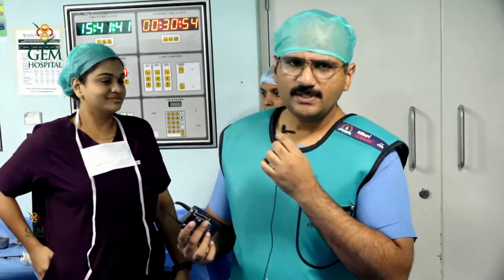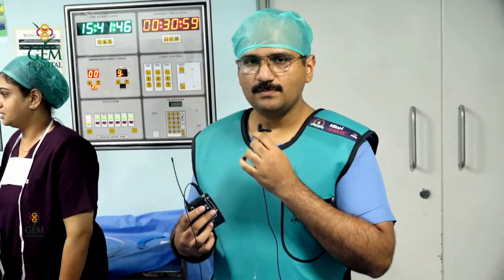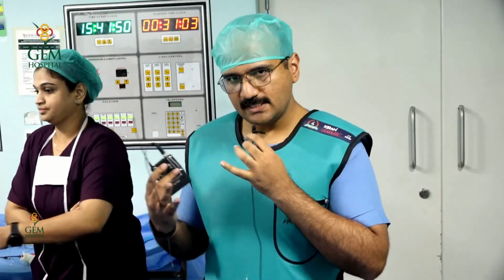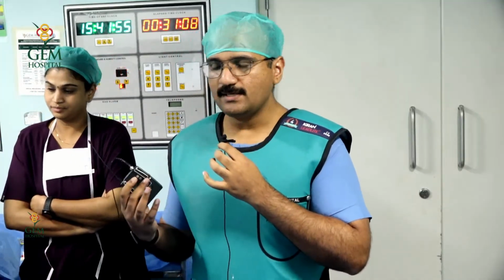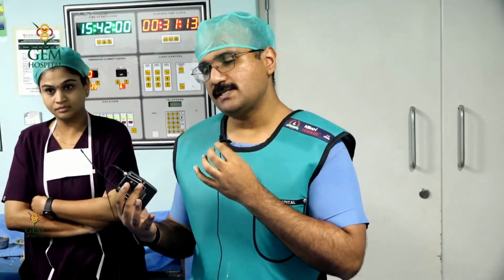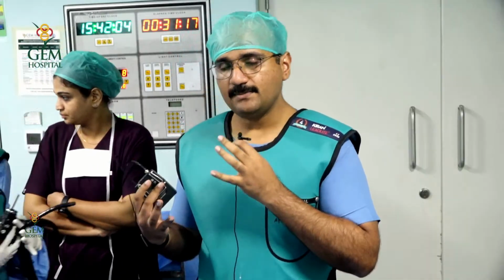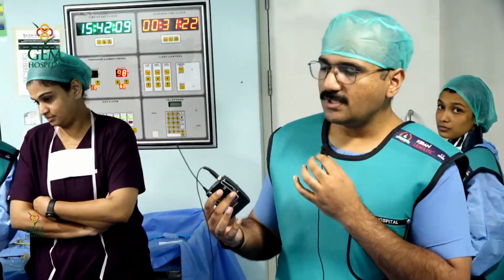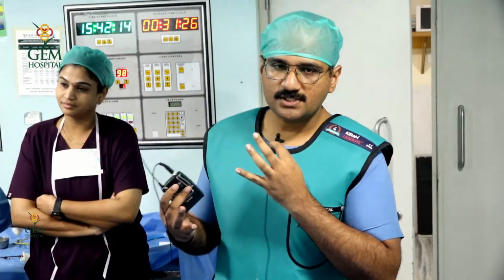The stent can be removed in 6 weeks. Ideally, if it were a tight stricture, we would have put two or more plastic stents in this patient to make sure it is dilated. There are also scenarios, such as chronic pancreatitis, where we have put metal stents, which are fully covered and removable. So that is also possible, even in benign biliary strictures. This stent will be removed in 6 weeks' time to give adequate time for the whole area to heal and to make sure the stricture is also palliated.